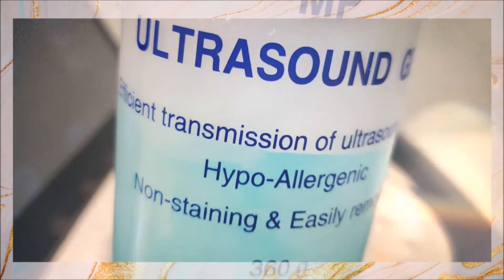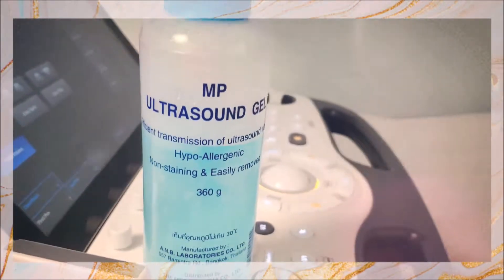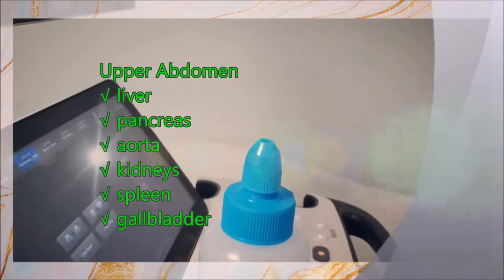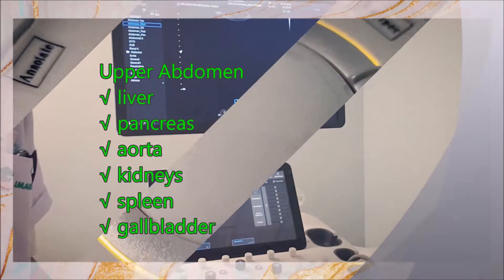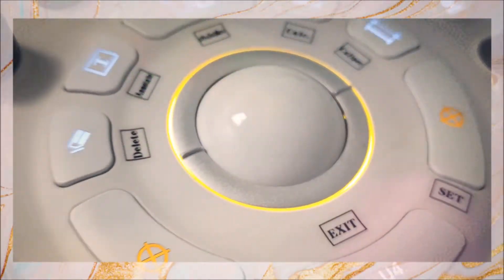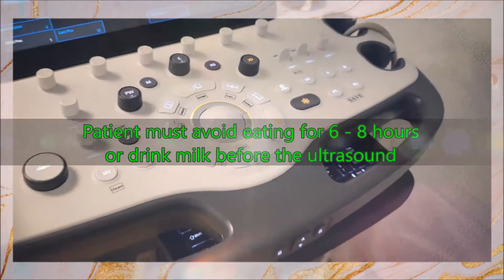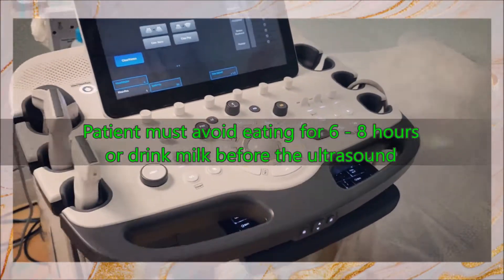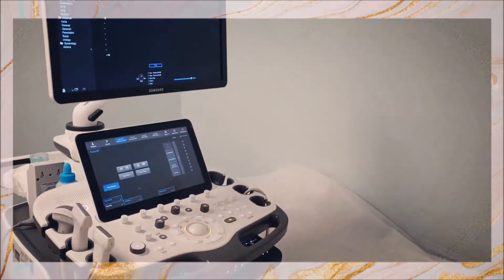What are the parts to be checked during the ultrasound of the upper abdomen? It includes the liver, pancreas, aorta, kidneys, spleen, and gallbladder. The patient must be instructed to fast — to not eat anything solid or drink milk — for 6 to 8 hours before the test, as this will affect the efficacy of the test.